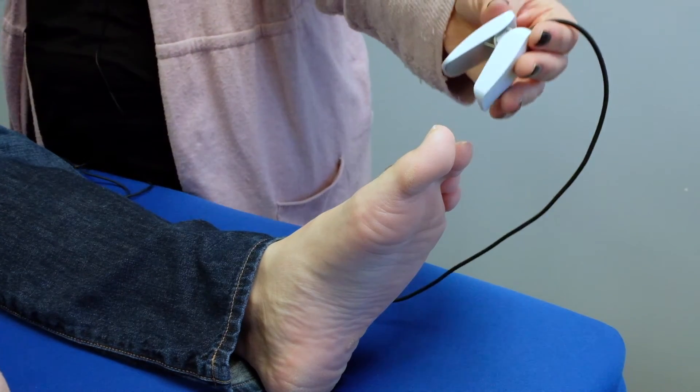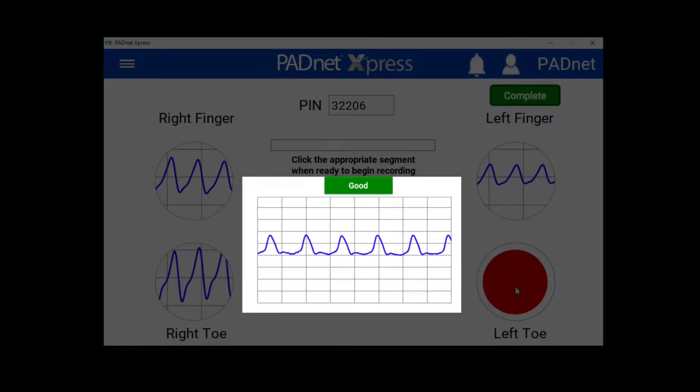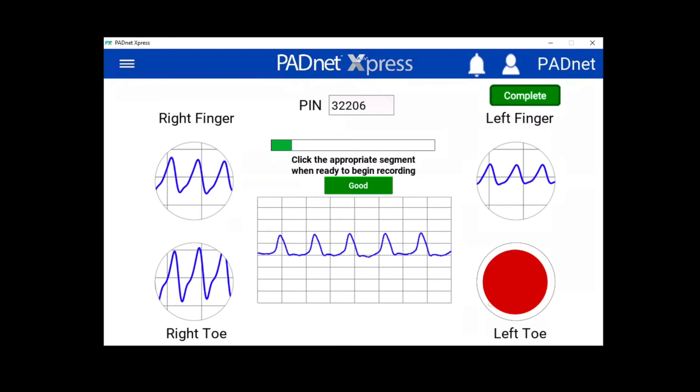Next, move the probe to the patient's other great toe. Click on next toe to record segment.